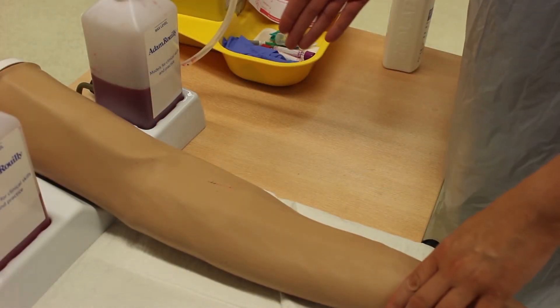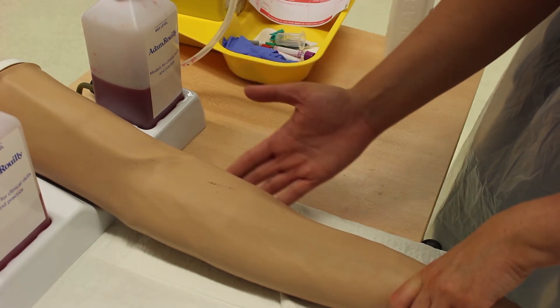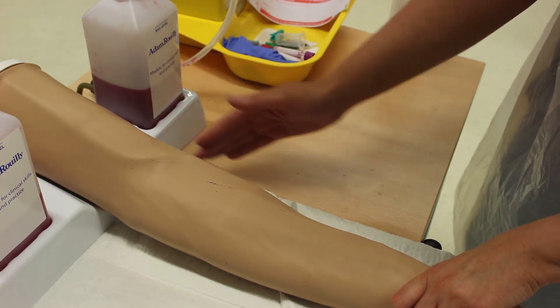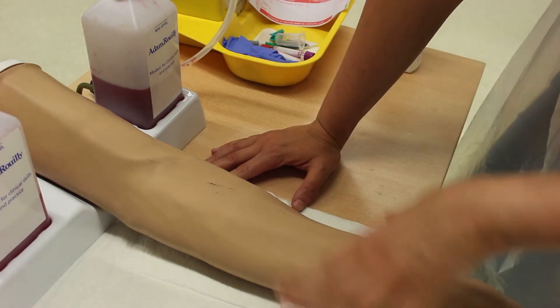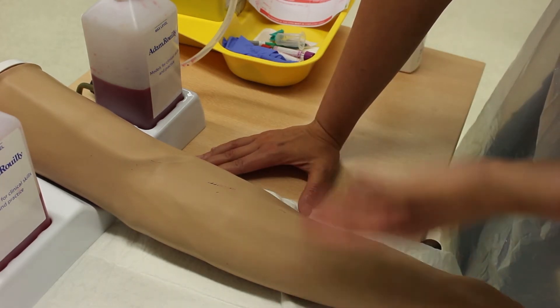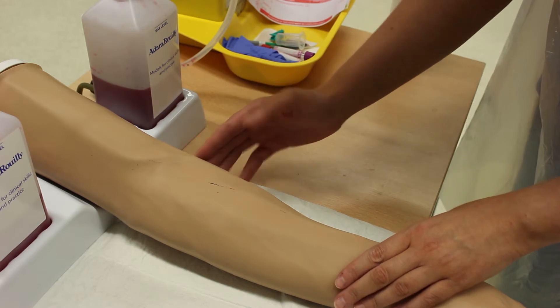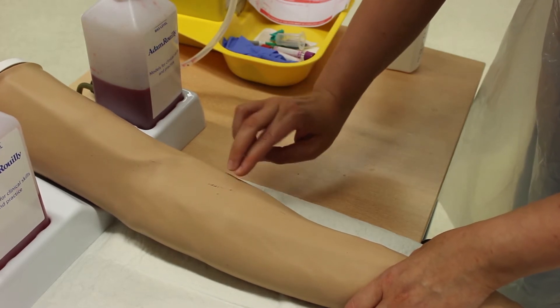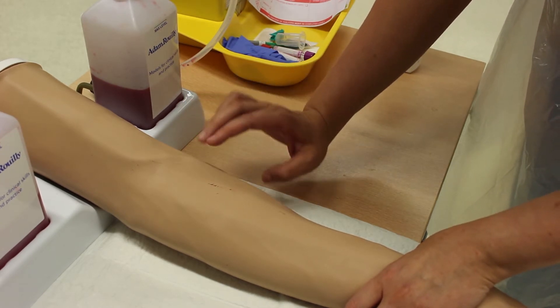For the clinical assessment of venipuncture, always use this framework: Check, Choose, Avoid, Do Not Use. Check the condition of the vein — no bruising, burns, marks, or swelling — and check their allergy status and medication history. Then choose the vein most distal in the non-dominant hand; choose veins that are firm, round, elastic, and engorged — what we call FREE.